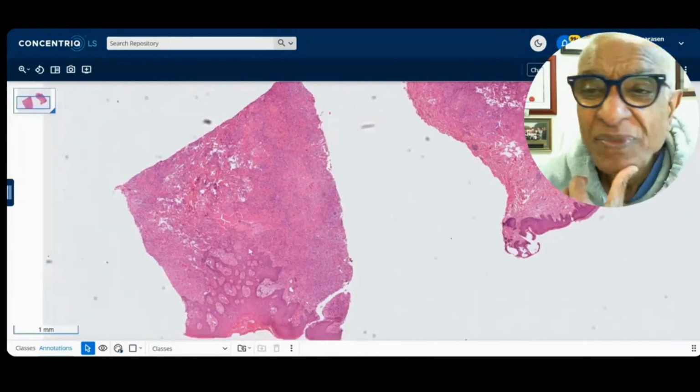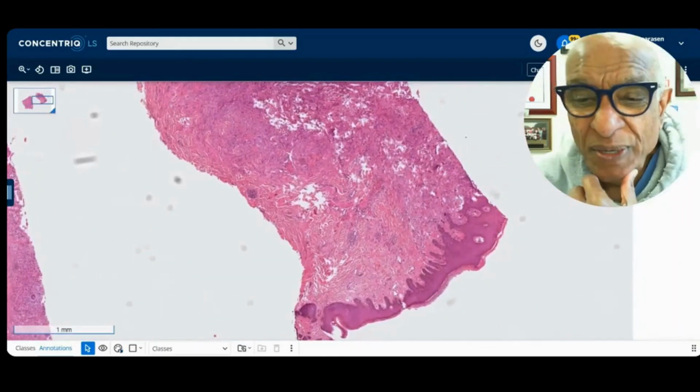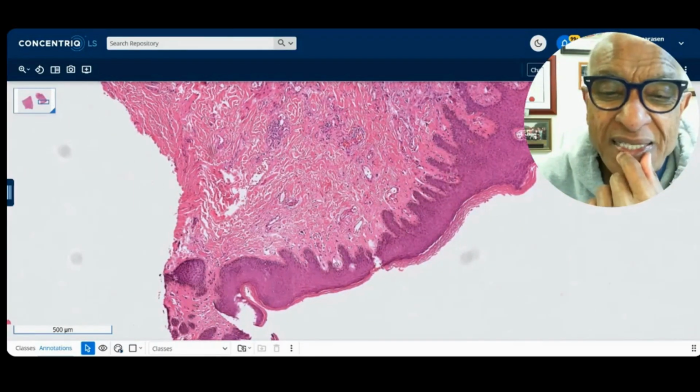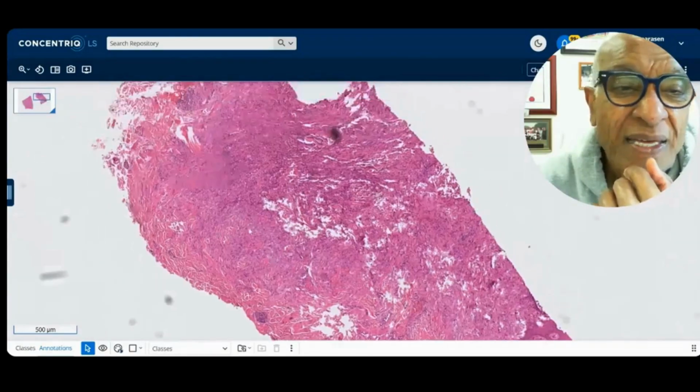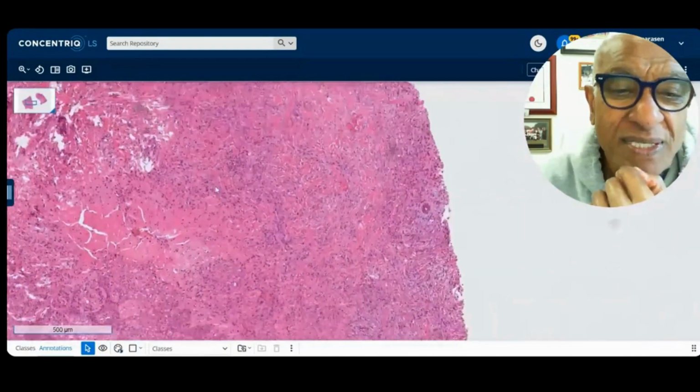And here, I'm just going to share it with you. So here you go, epidermis, scrotal mass. Remember, it's in the scrotal skin. Here's the epidermis. And that there is where this neoplasm is. Let's go down and look at it here. It's better seen here.